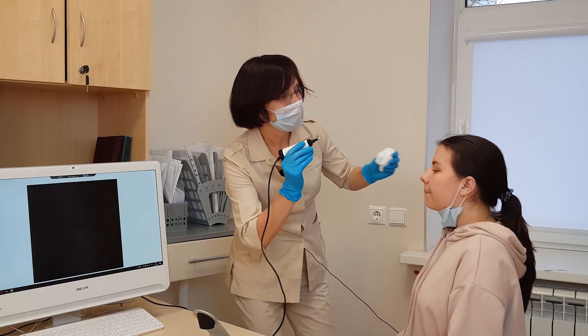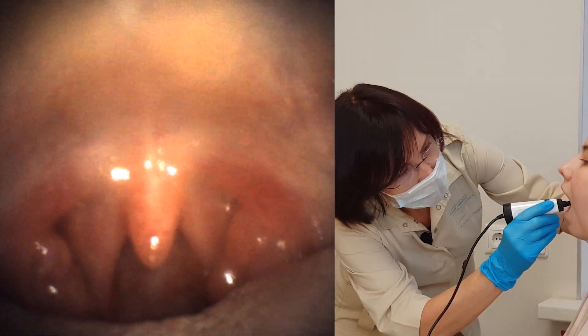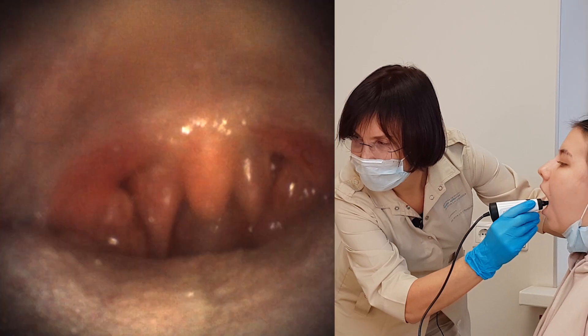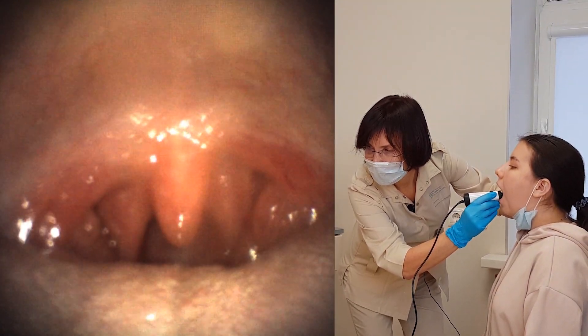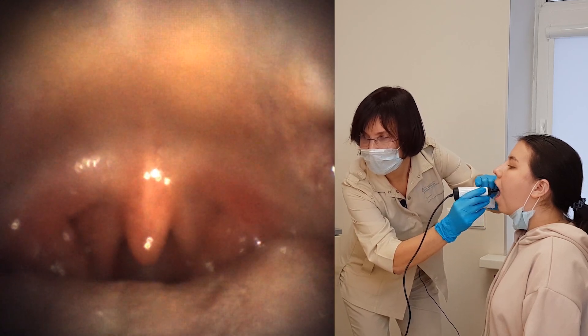Please show me your throat. You see the throat of the patient in detail. Push the button and make a photo.